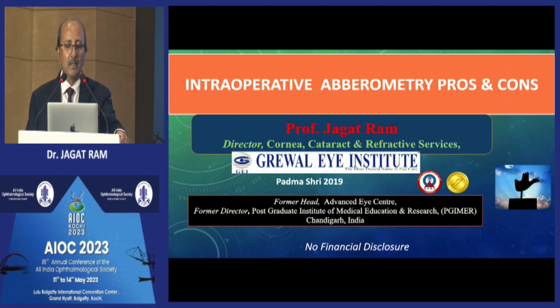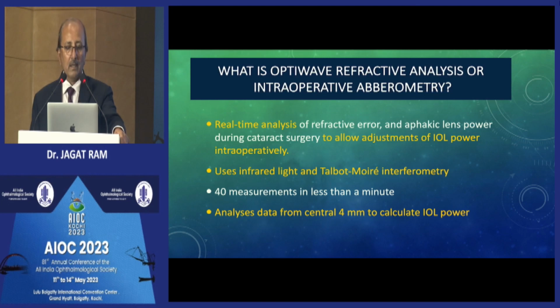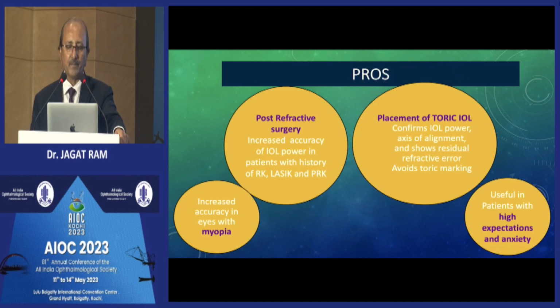Thank you, Dr. Shri Ganesh, for giving me this opportunity. I will be speaking on intraoperative aberrometry pros and cons. Real-time analysis allows adjustment of IOL power intraoperatively, and we use infrared light and interferometry. Analysis of the data from the central 4 millimeter calculates the IOL power.